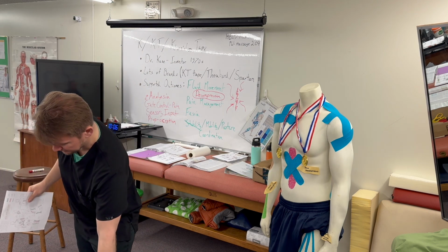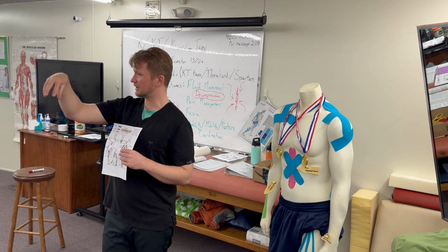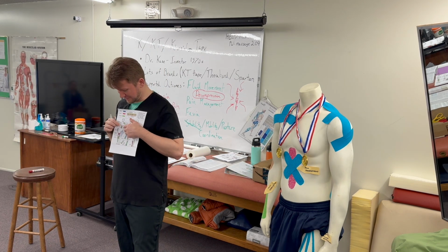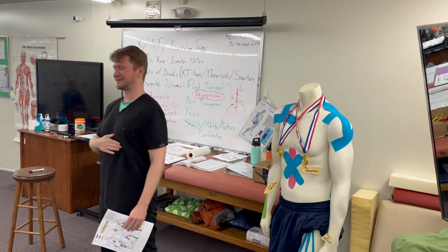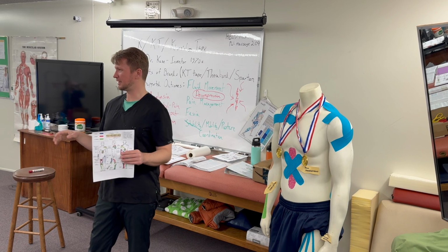There's a superficial nerve on the lateral side of your feet. That can be a good way to use it. It's just a way to pull the skin up, thinking like a tape cup. So that's what that one is. Everybody always is like, why would I put it there? Not usually is somebody gonna point, it hurts right there. There we need to encourage better breathing. So you could use that star shape anywhere.